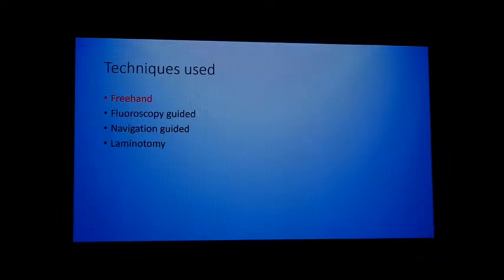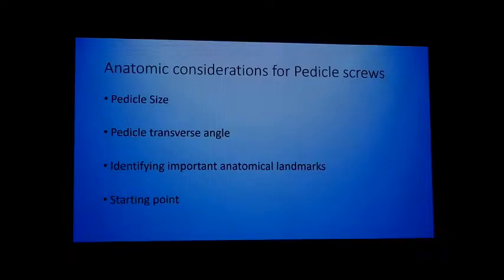Now, I am going to present basically about the freehand technique used. The others are fluoroscopy guided, navigation guided, laminotomy. So what are the main considerations when you insert thoracic pedicle screws?